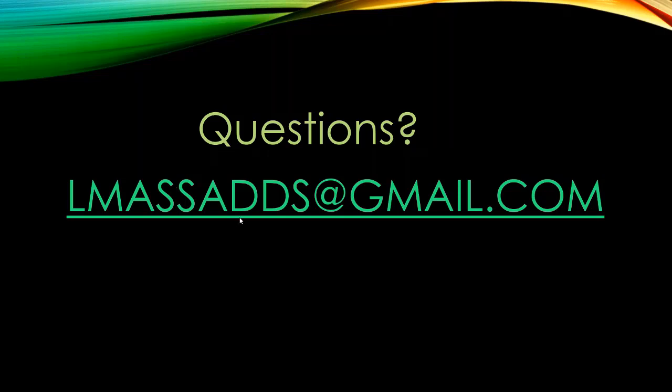Next question here. Once the guide is made, can the choice of the site be made and still, like this says, still maintain accuracy?